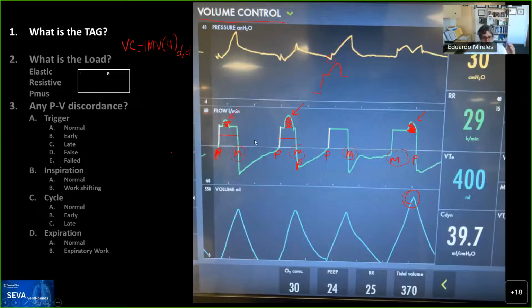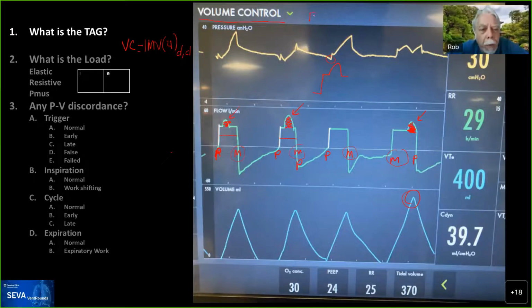So this behavior is totally under the control of the operator on this ventilator. On other ventilators, particularly older Servo-Us, this behavior was default and you couldn't change it. So it just depends on the software version that the ventilator has. The GE ventilators do something very similar as well, and that also is a default. You can't change it. Very good.